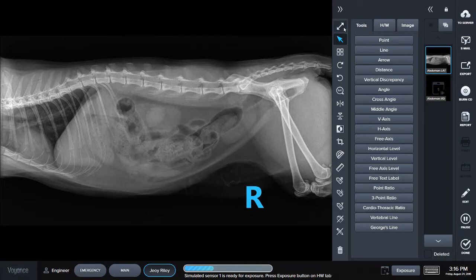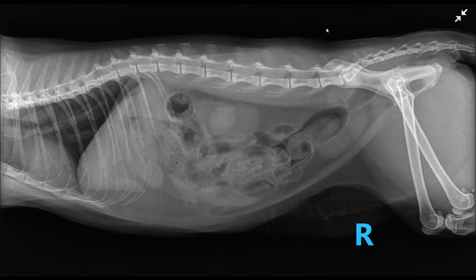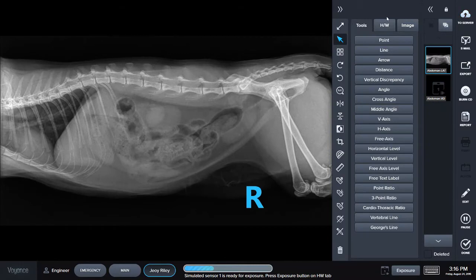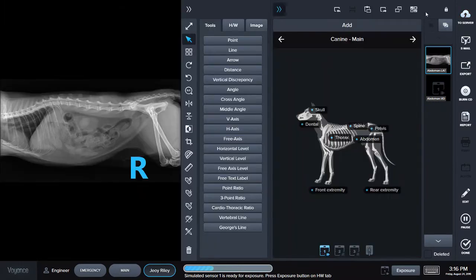Once I'm done editing, I can switch to the full screen page right here at the top corner, and this takes away all of the sidebars to just give me the image. If I need to add additional images, I go to the second sidebar. This is all on the same page — you don't need to exit out of your study to add anything.